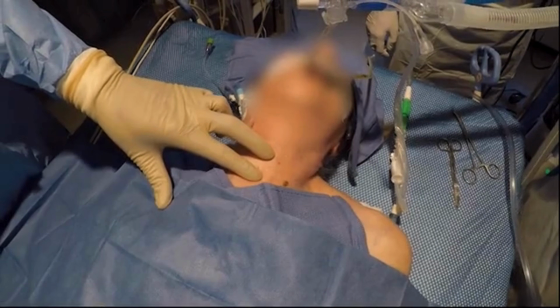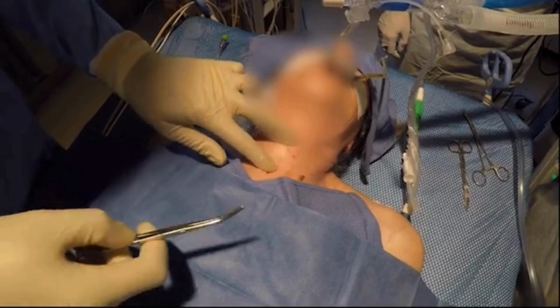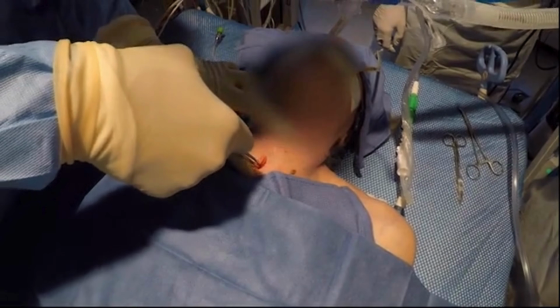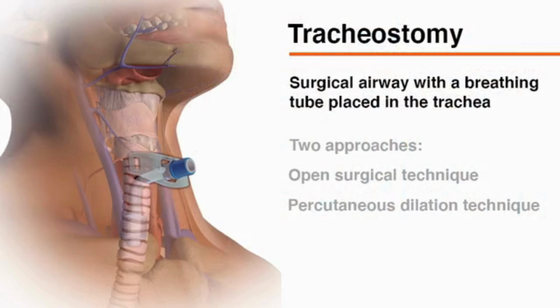This video demonstrates percutaneous tracheostomy techniques for intubated patients requiring a prolonged airway or those on mechanical ventilation. A tracheostomy creates a surgical airway maintained by a breathing or tracheostomy tube. This tube is inserted directly into the trachea through a neck incision.